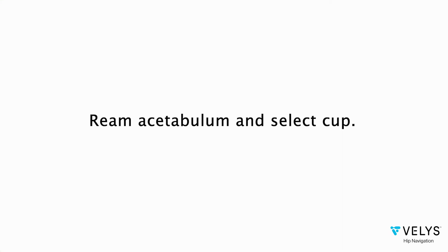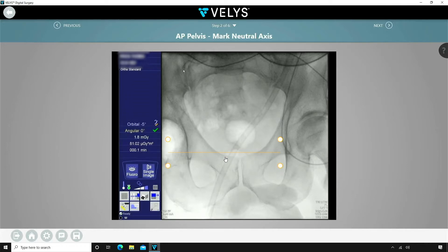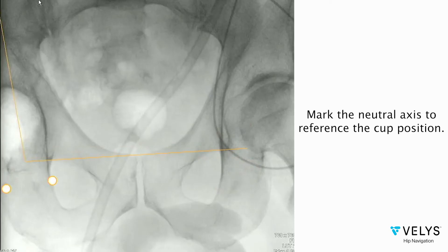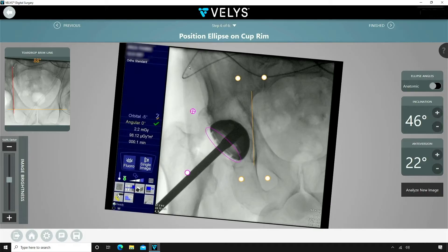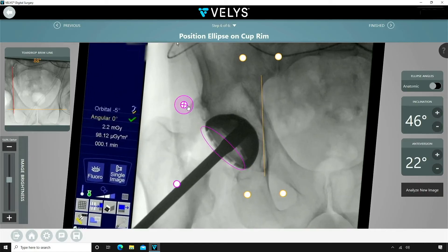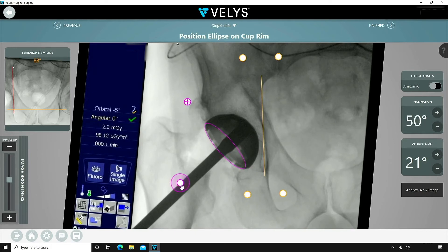Ream the acetabulum and select the cup size. Placement of the cup is done by first obtaining a neutral pelvic image. The cup is impacted using Concise. Velis is then used to tell you your current cup position. On my first attempt, my cup is too vertical.